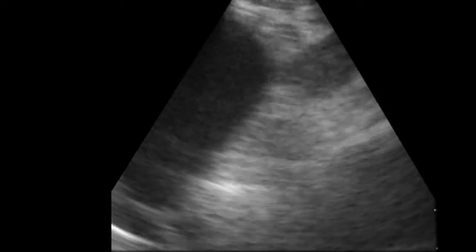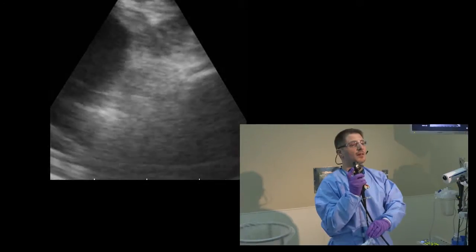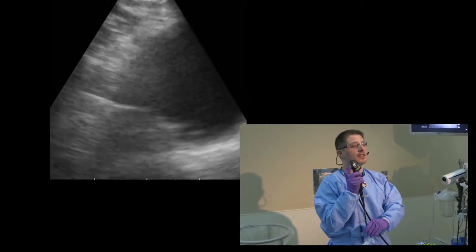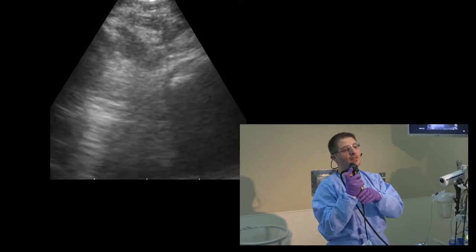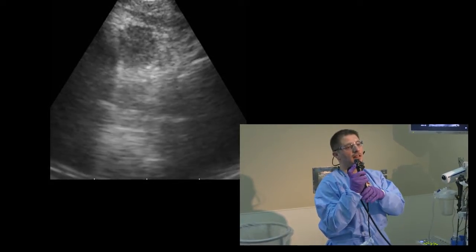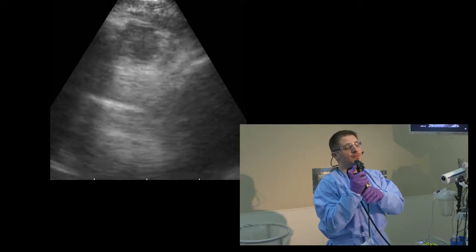Again, this is the 4L location. By ultrasound, you can see the pulmonary artery. Pulling up toward the head, you can see the lymph node. Pulling up, you see the aorta. This is the only lymph node that's located between the two large blood vessels, and that's a very important landmark in the ultrasound to identify this lymph node.